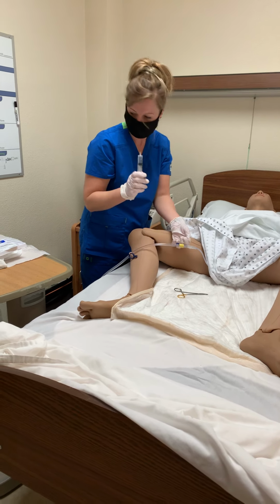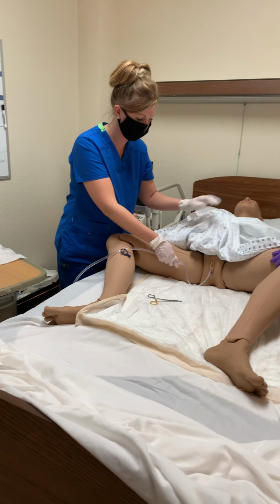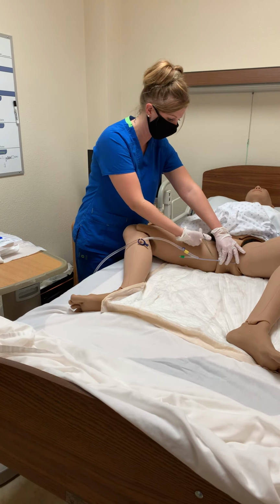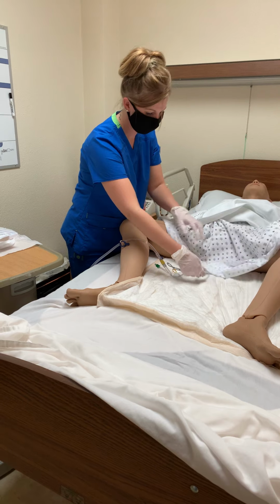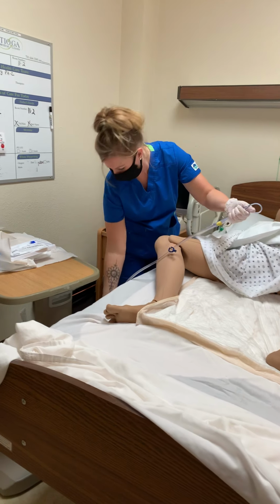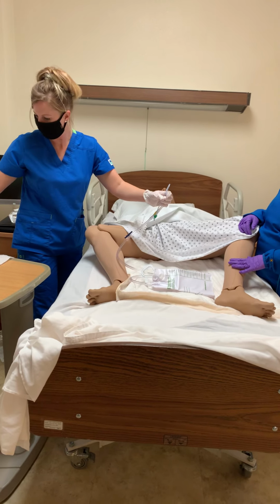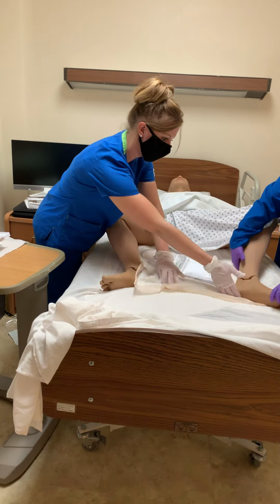I would have checked the order in the MAR to ensure that it was 5 milliliters and not more. So now I would clamp. Ask Joanne to take a deep breath. And I am going to pull. Ready, Joanne? Yes, ma'am. 1, 2, 3. And there we go. I would clean her up as needed. I'm going to take all of this. I'm going to take the check.